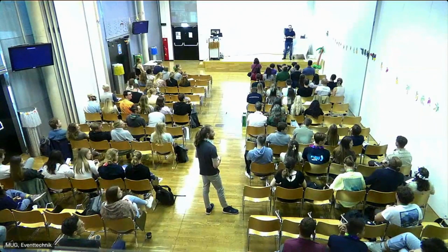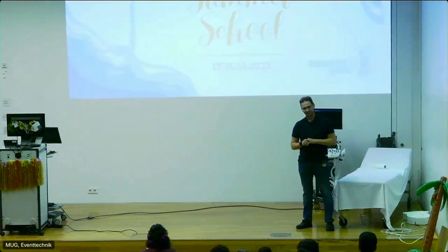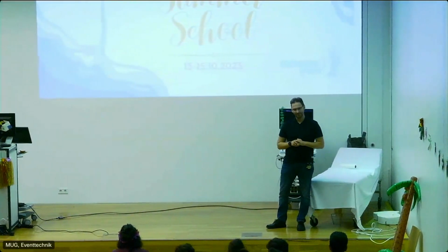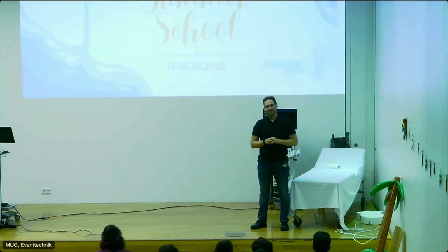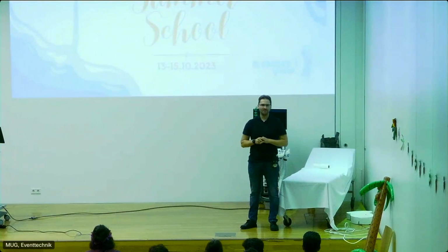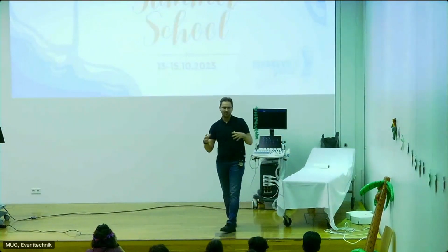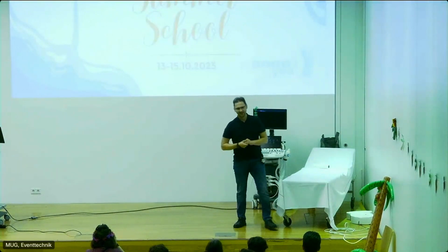Okay, so that was for my clarification. Thank you very much. And another question. If you use a vacuum mattress for some polytraumas, do you do the eFAST before, because after it, you can't really reach the left and right sections and check it, or do you just go directly to CT and check the abdomen a little bit? How is your approach different in this situation? Usually on scene, it's no problem because we do the eFAST before the patient is put in the vacuum mattress.